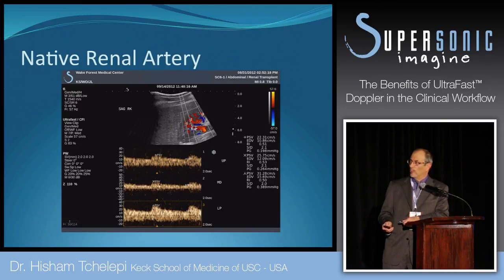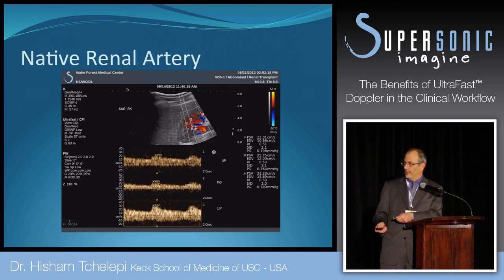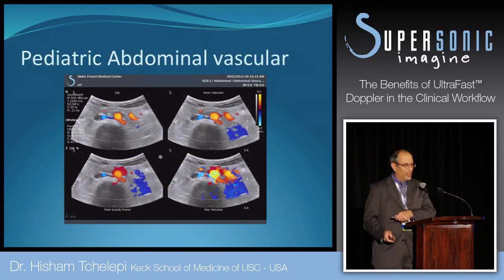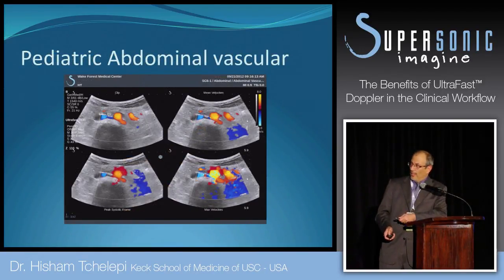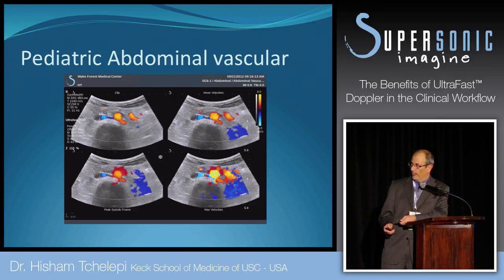From the same kidney in one sweep, we look at the intrarenal resistive indices — we can do the renal artery outside the kidney and the resistive indices inside the kidney at the same time. This is an eight-year-old child with hematuria that couldn't be explained. You can see data being picked up at different levels, including maximum velocity, peak systolic velocity, median velocity, and mean velocity — all available to go back and forth for measurements.